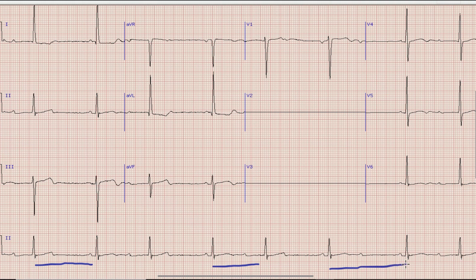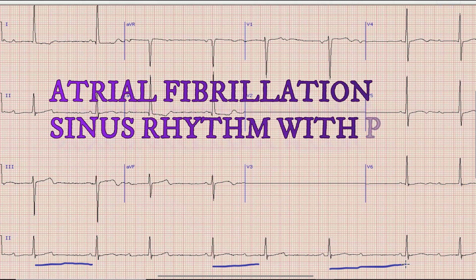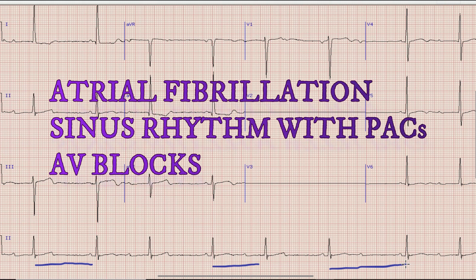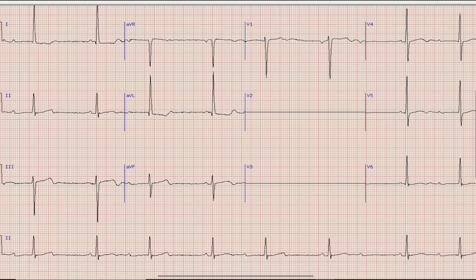There are multiple causes of irregular RR interval, or irregular rhythm. These include atrial fibrillation, which is not the case here as there are prominent P waves. Other causes include sinus rhythm with premature atrial contractions and certain heart blocks. To find the most accurate diagnosis we will stay focused on the rhythm strip.